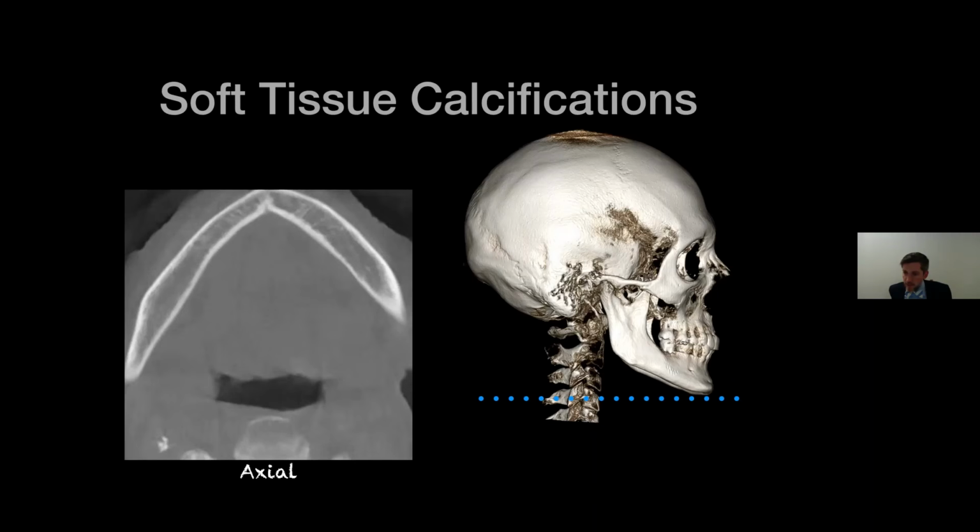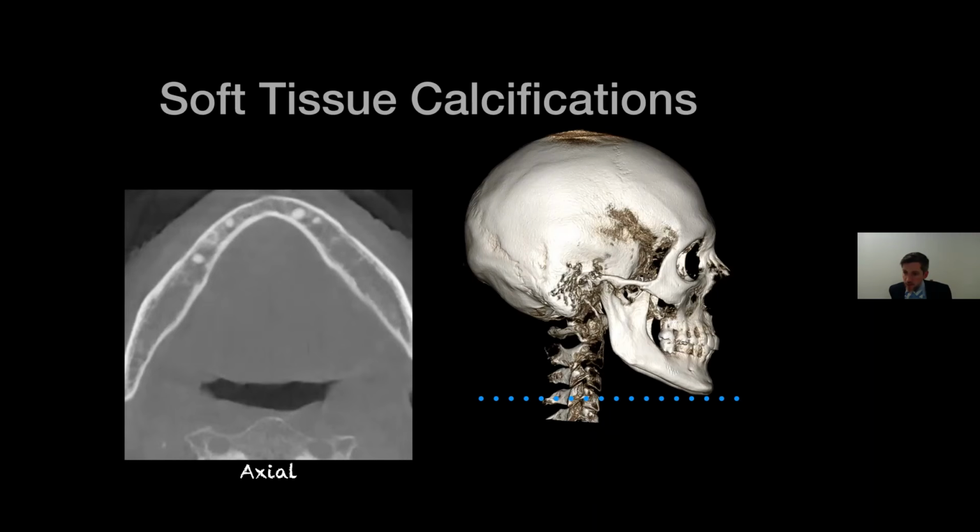If it is the dentist who will do the interpretation, will it stand in court for litigation cases? Yes. So likely a question that would come up is, did you seek a second opinion from your colleague across the street on the particular diagnosis? I think where litigation is going with regards to imaging and dentistry is more along the lines of, did you use cone beam or not for a particular case.